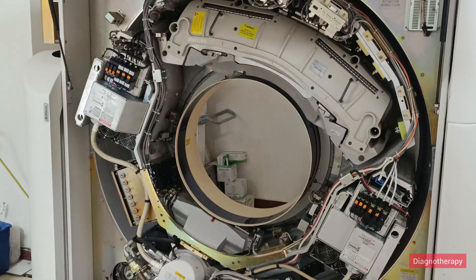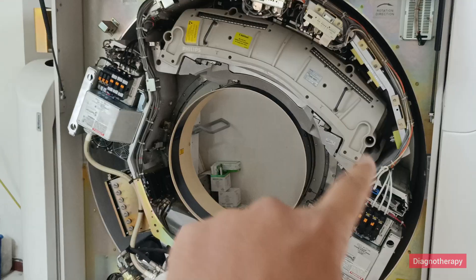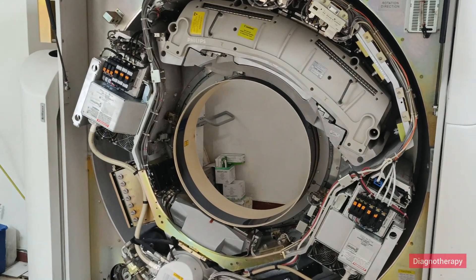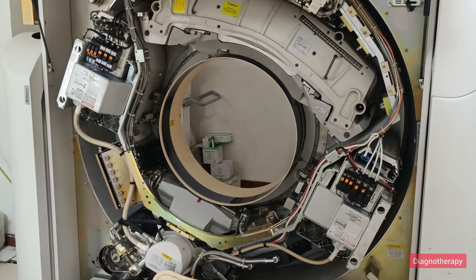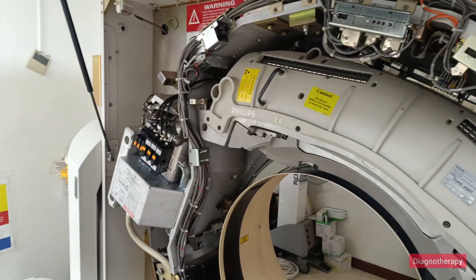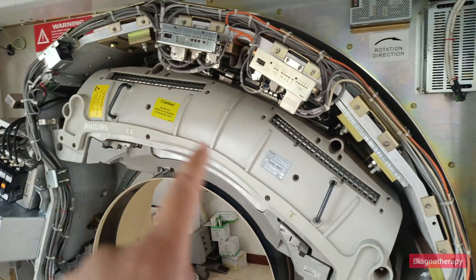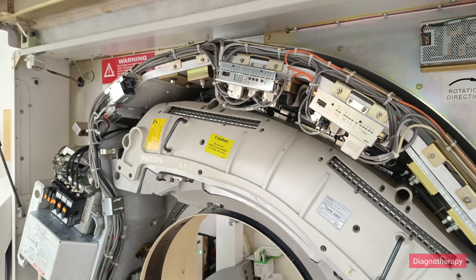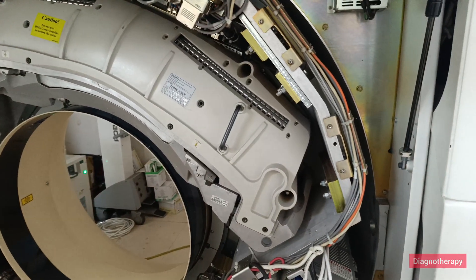Here you can see the x-ray tube and the detector — you can see the array of detectors. This is the anode and this is the cathode; these are the tanks of the x-ray tube. You can appreciate the arc structure of the detector array, which detects the x-ray signals and converts them into electrical signals.